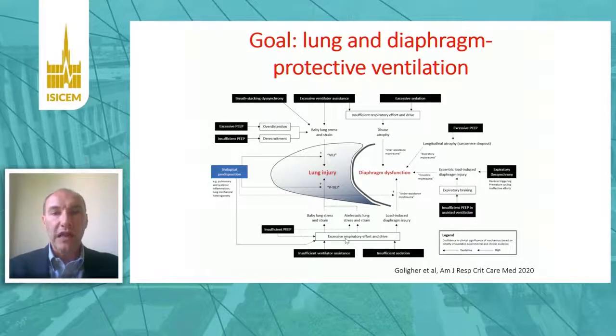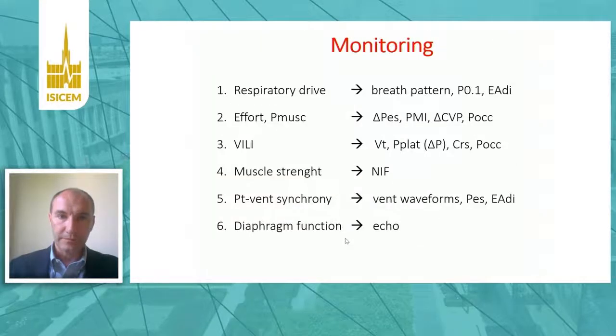So what is called the lung and diaphragm protective ventilation, as reviewed in this very nice paper that I've been working on together with Johan Goliger and other experts in the field, and that has been just published in the Blue Journal. So to achieve the goal of properly set spontaneous modes of ventilation in order to obtain lung and diaphragm protective ventilation, it's extremely important to monitor the patient.